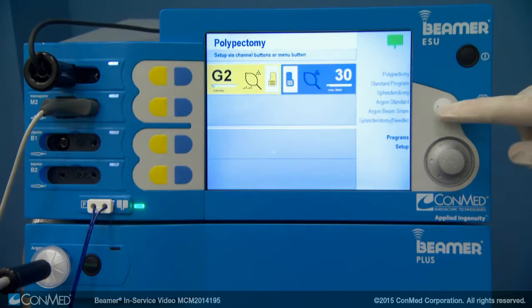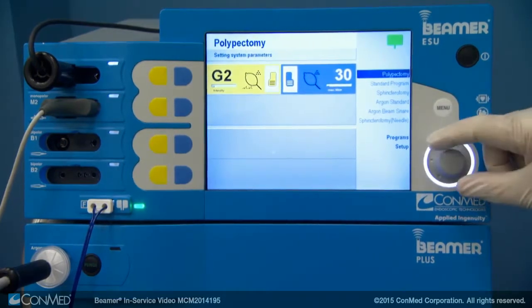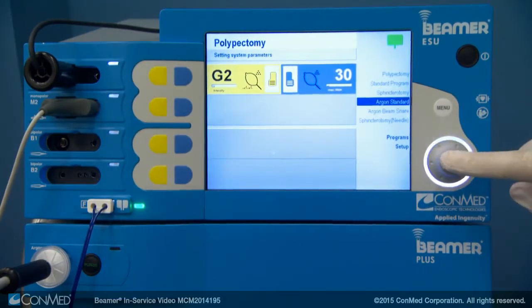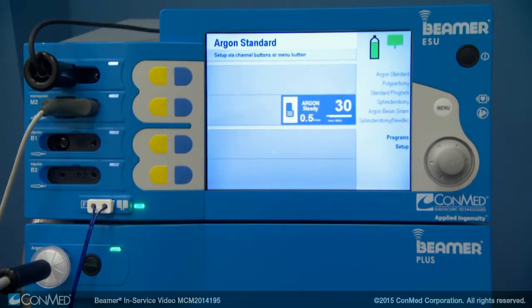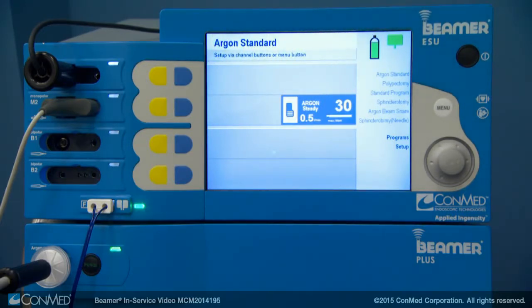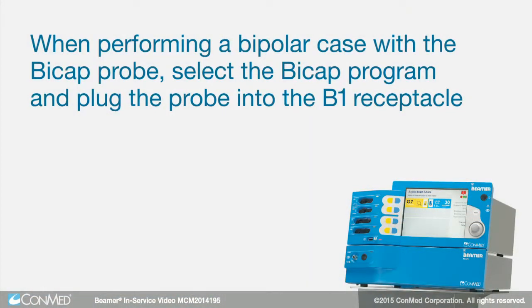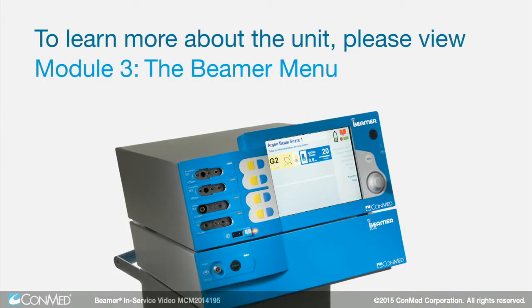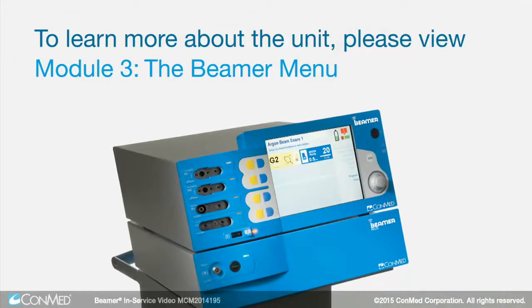To set up for an argon case, press the menu button and scroll down to the argon program you want, then press the rotary switch. Notice that the first line, M1, goes blank and the display shows the settings for doing an argon case on the second line, which is where we have the argon cable attached. When performing a bipolar case with the BICAP probe, simply select the BICAP program and plug the probe into the B1 receptacle. To learn more about the unit, please view the next module.